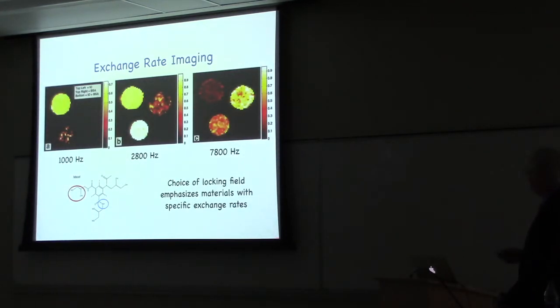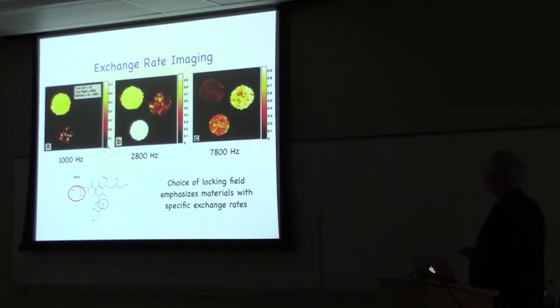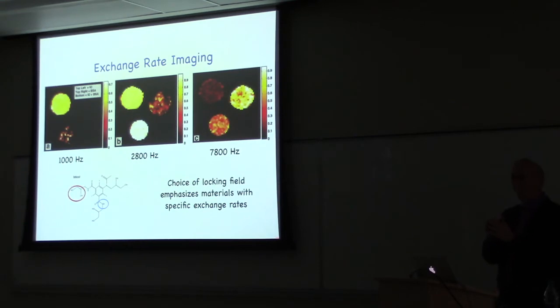This is one example of that. We actually looked at these exchanging protons, and this is actually X-ray contrast agent that's FDA approved. And this is showing this exchange rate contrast when we pick out that different intermediate frequency. We can isolate this example, which is just the iohexol. We can move it up higher, and we can accentuate this, which is now the iohexol with BSA. And then this is moving even further, where this is the iohexol. This is now just BSA on its own. So this told us that we could, in fact, manipulate contrast according to the exchange rate of the protons.